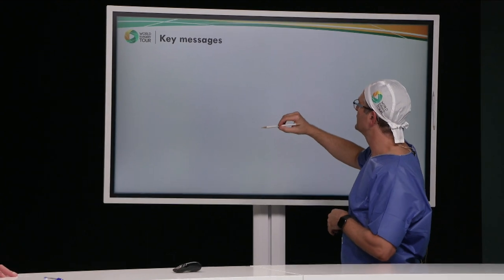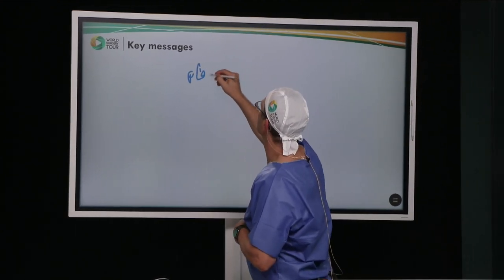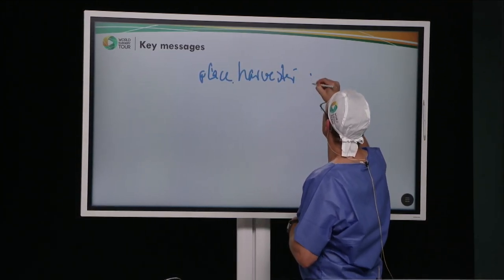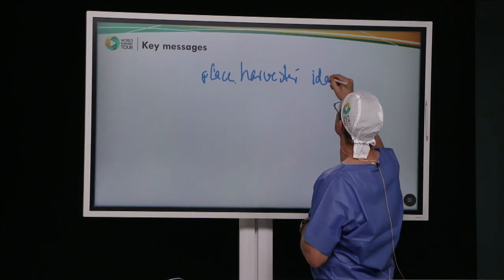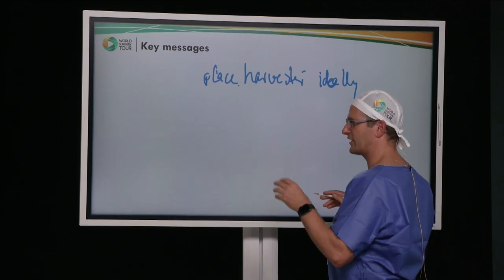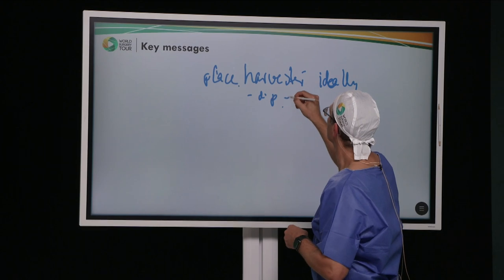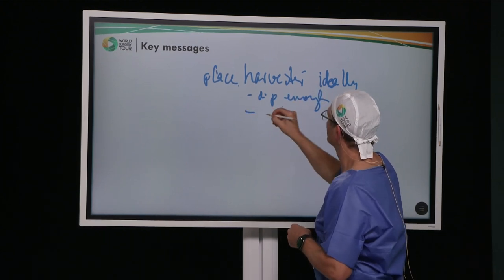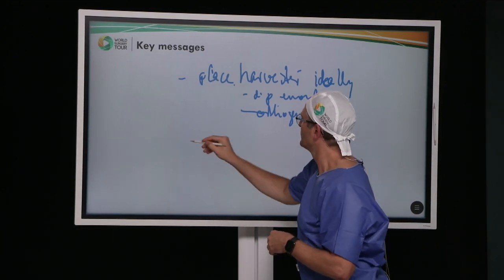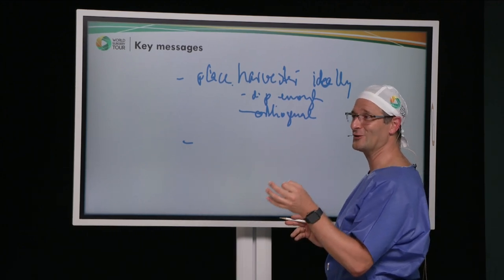you need to be able to really place the harvester ideally, depth-wise, so that it's really stable in the cartilage, and also that you are orthogonal. So that is deep enough, and orthogonal.